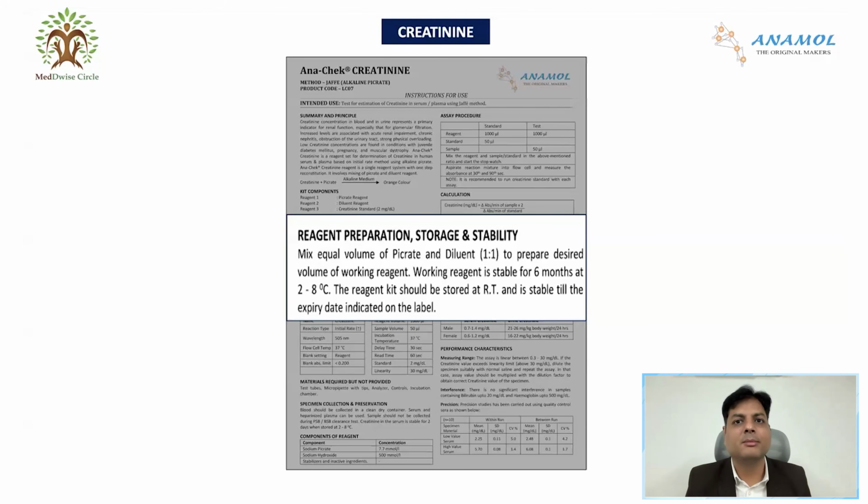Now, reagent preparation is nothing but preparation of working solution. Because we have discussed in our previous lectures that when we take the reagent in the test tube and when we add patient sample into the test tube, the sample and the reagent will start the reaction. Now, what is this reagent? This reagent is not the reagent which is given in the kit. This reagent is called working solution.